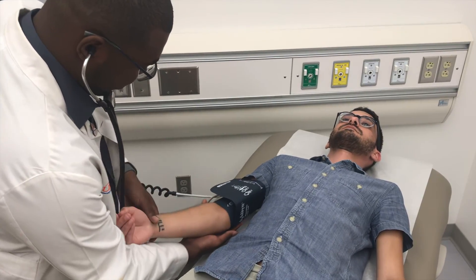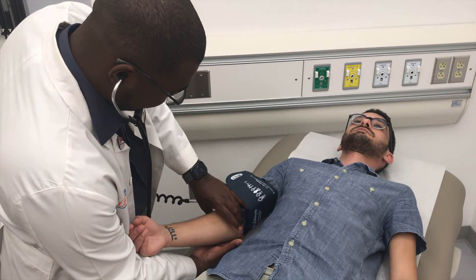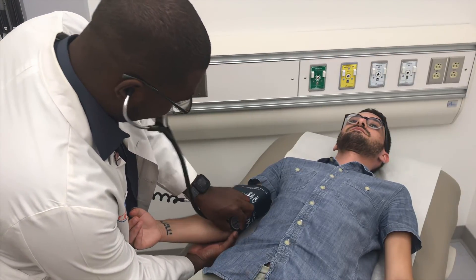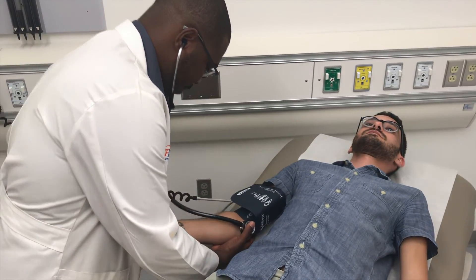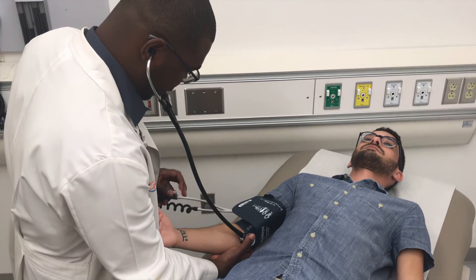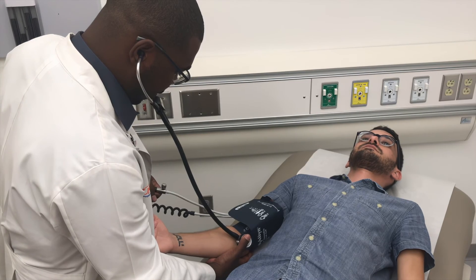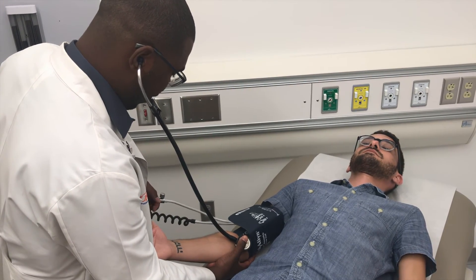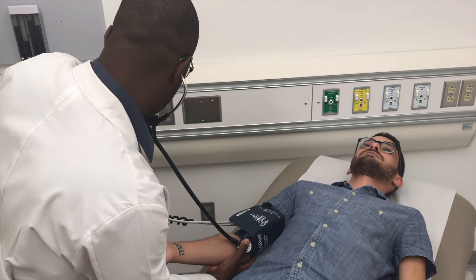To perform the special test for orthostatic hypotension, begin by having the patient lay down flat on the exam table in a calm, quiet room, and leave them undisturbed for 10 minutes. After 10 minutes, return to the room and record the blood pressure while the patient remains in the supine position. Once this is done, deflate the cuff but leave it attached.